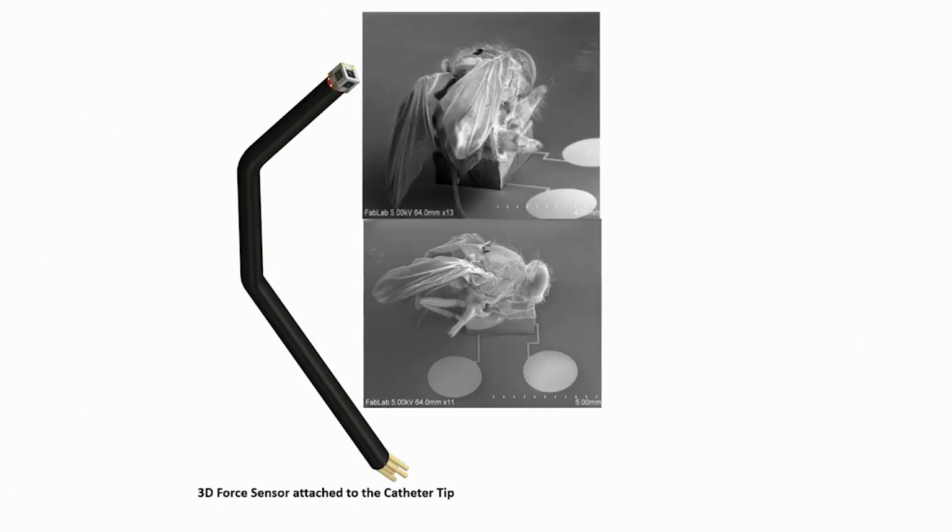Now, here what you see is a house fly, right. A house fly is sitting on the sensor, and the interest of making the house fly sit on the sensor was to measure the weight of a house fly, right. It is a strain gauge, on a flexible material that we have used, again PDMS, right, and on the strain gauge there is a cube.